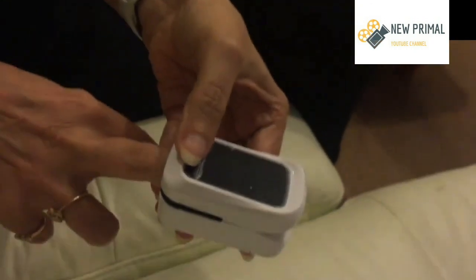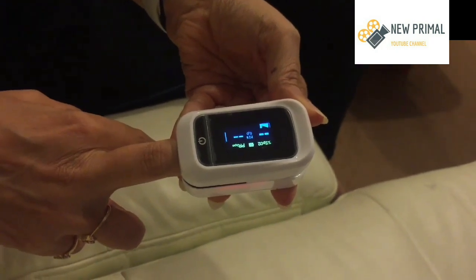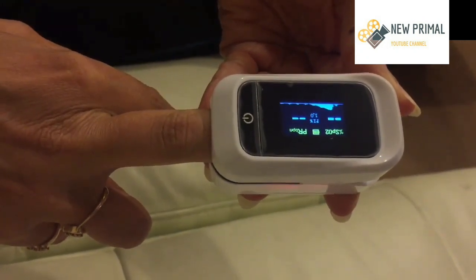So you insert a finger without nail paint and with a shorter nail. Make sure the machine is on, allow it to calibrate, and it's doing its reading.